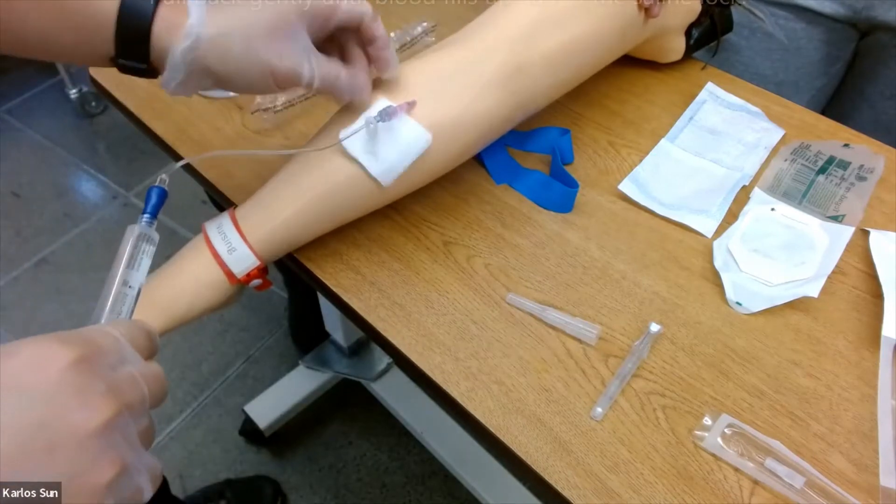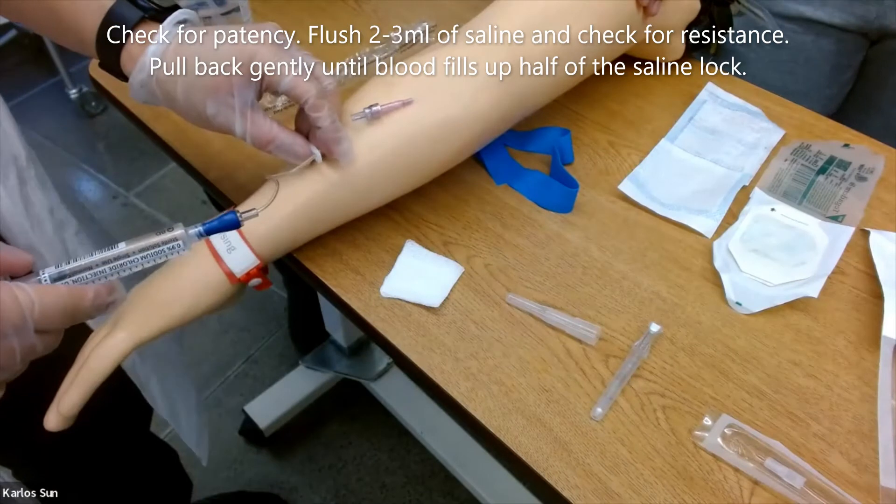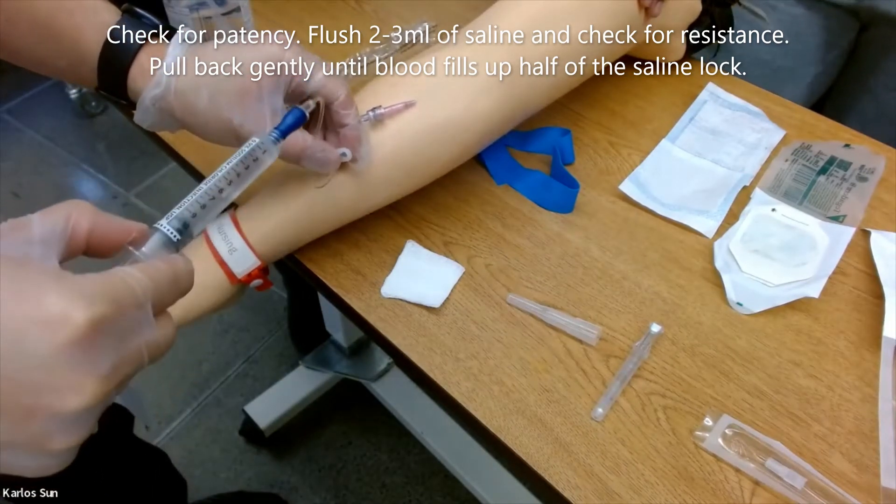Check for patency by flushing two to three milliliters of saline and checking for resistance, then pull back gently until blood fills up half of the saline lock.